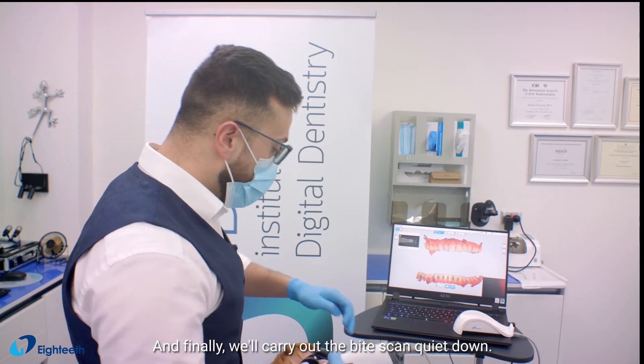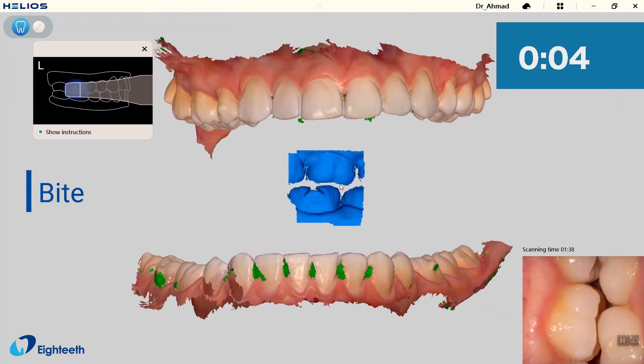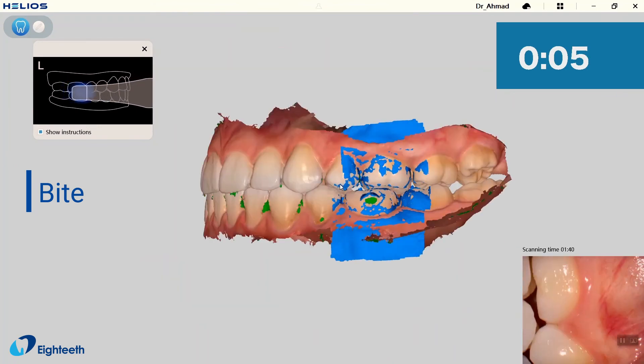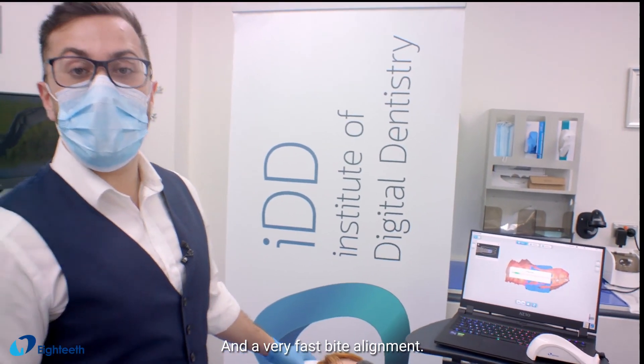And finally, we'll carry out the bite scan — bite down. And a very fast bite alignment.